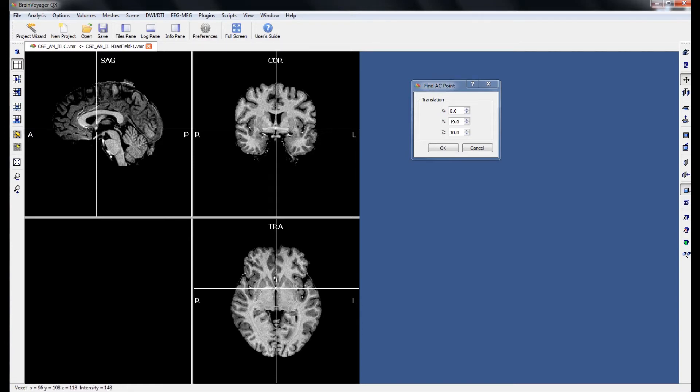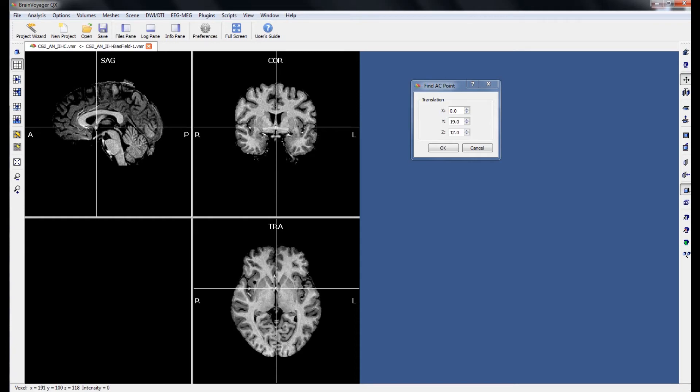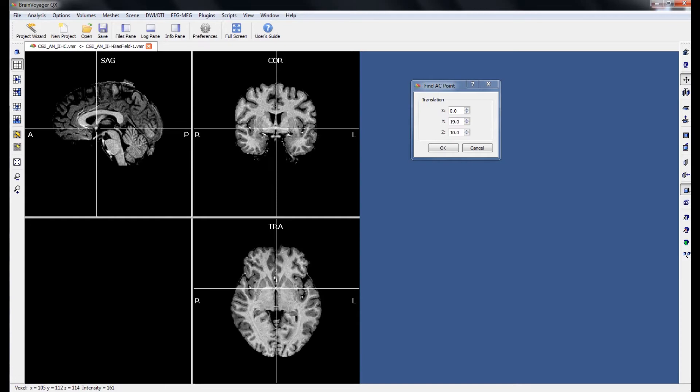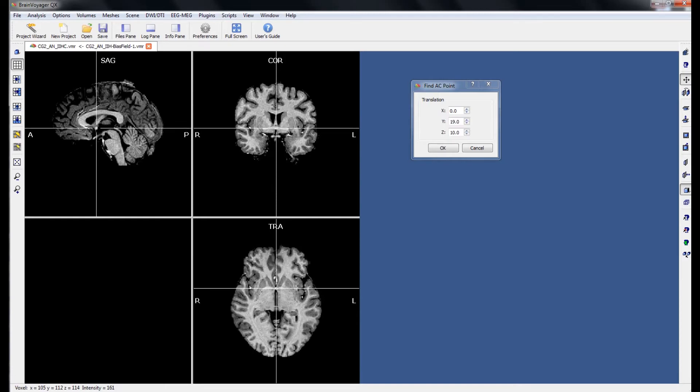Our job then becomes to use the up and down arrow keys to find the transverse slice where this bridge is at its most well defined.